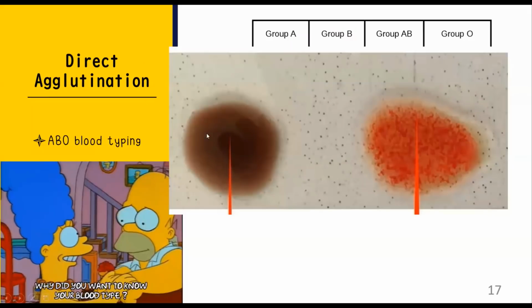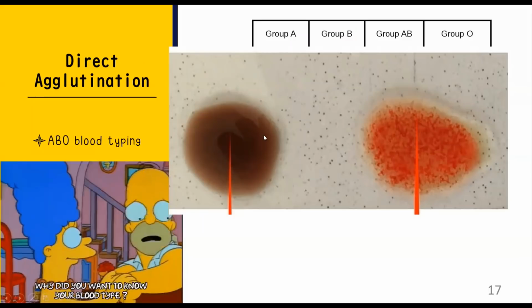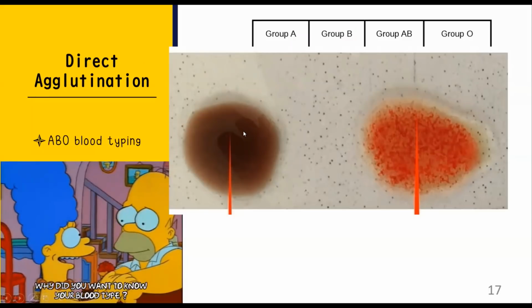So, in this part here, there is no agglutination. As you can see, homogeneous ang mixture. Whereas in this reaction, there is a visible agglutination. No? So this one here, absence of agglutination, therefore absence of the antigen. Presence of agglutination, therefore presence of antigen.